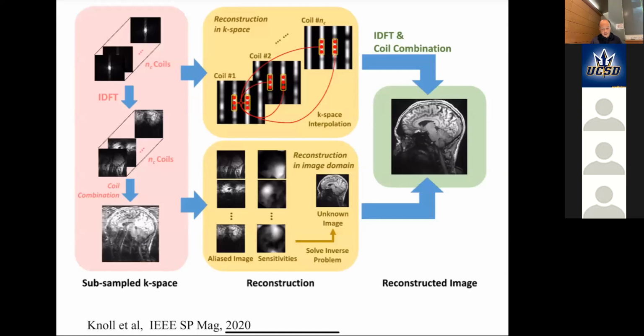But before we do that, I think everyone did pretty well on the pre-lecture quiz, so that's good. The one thing I want to emphasize is that with GRAPPA, each coil is reconstructed on its own. So you can have a case where all the coils have good profiles, but one doesn't. In that one question, we're specifically asking about coil 1, where it had the flattest spatial profile. Therefore it's going to have the narrowest k-space profile, so that would be worse for GRAPPA.